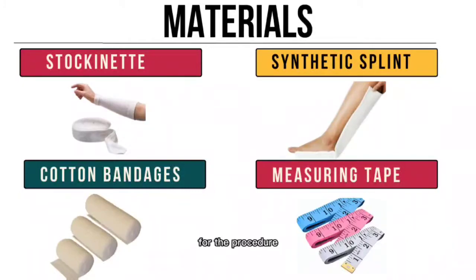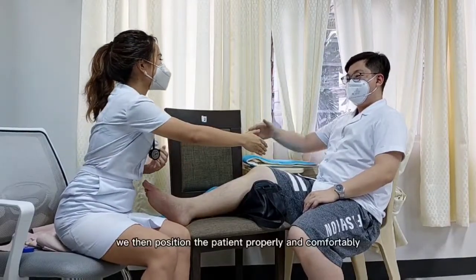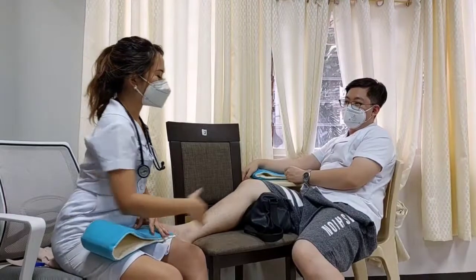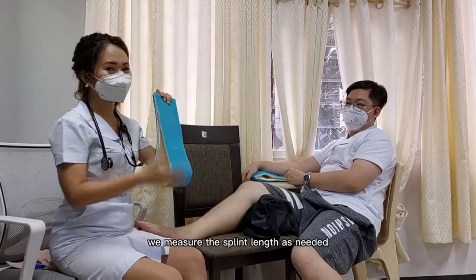For the procedure, first we introduce ourselves to the patient, explain the procedure, and secure their consent. We then position the patient properly and comfortably. We can place a rolled-up pillow under the patient's knee for ease of splinting and for the patient's comfort.